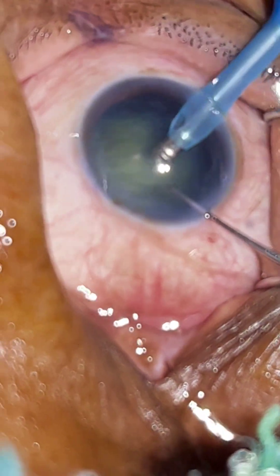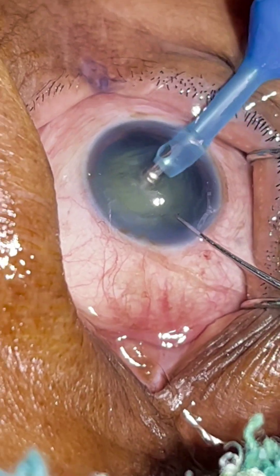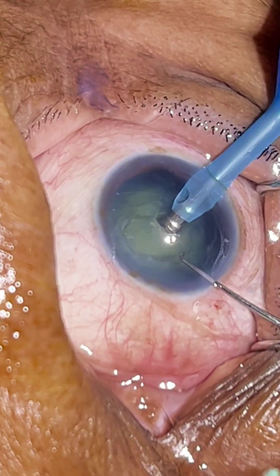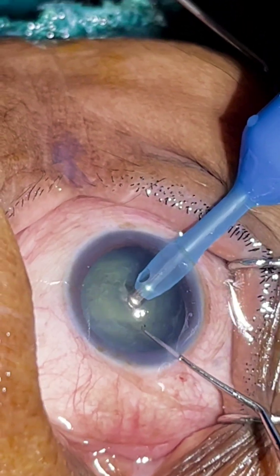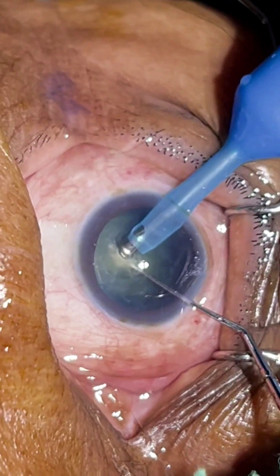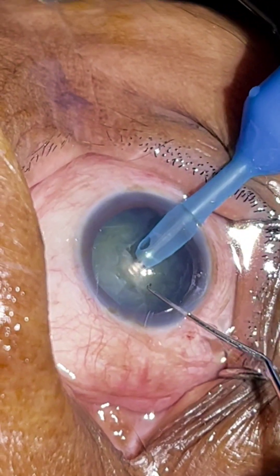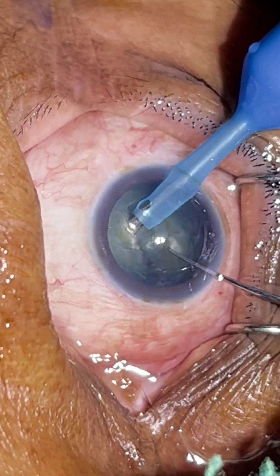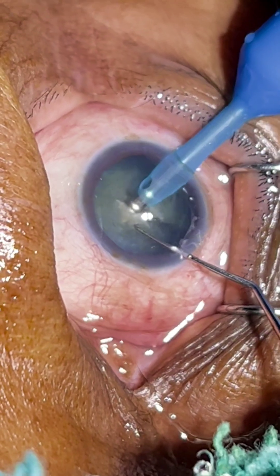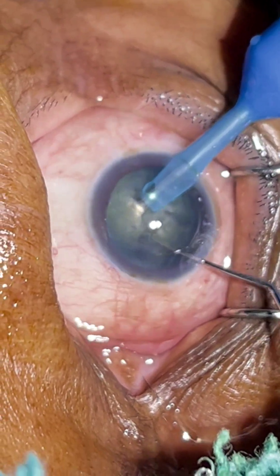With 5% energy I am aspirating the superficial cortex. Here I am doing a groove. See here how nicely the first chop happened — if the vacuum is good, the chopping becomes easier.